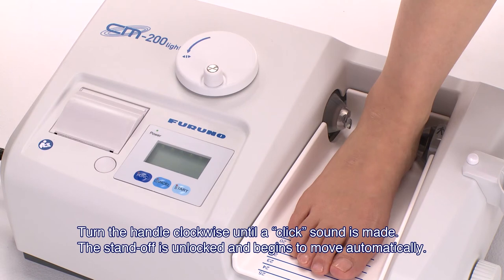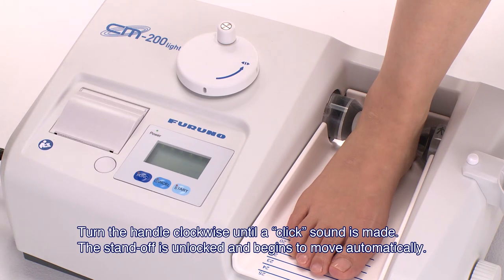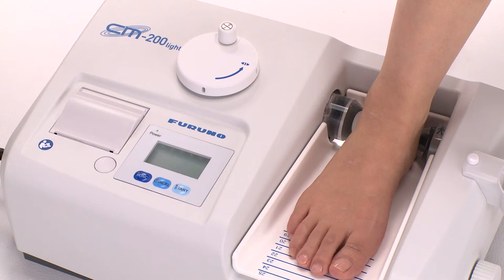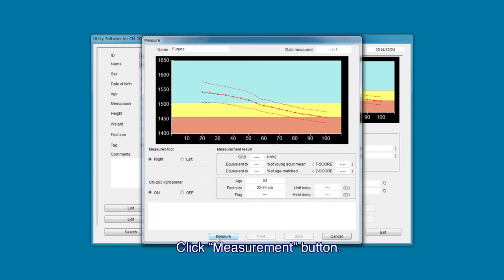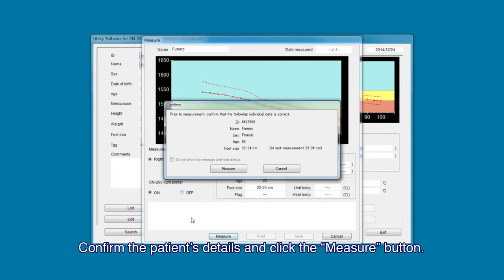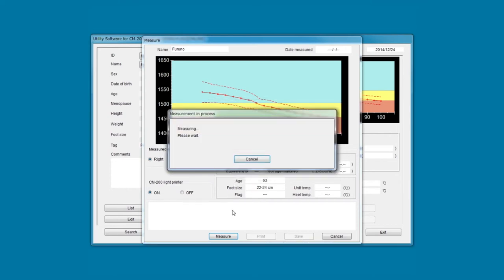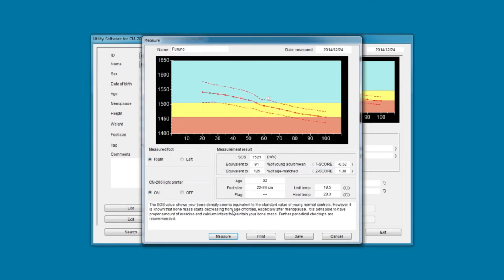Turn the handle clockwise until a click sound is made. The standoff is unlocked and begins to move automatically. While the standoff is moving, release the handle and wait until the standoff holds the patient's heel tightly. To begin the measurement, click the Measure button. Confirm the patient's details and click the Measure button. The measurement process takes approximately 3 to 10 seconds to complete.